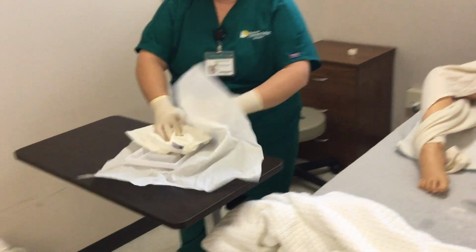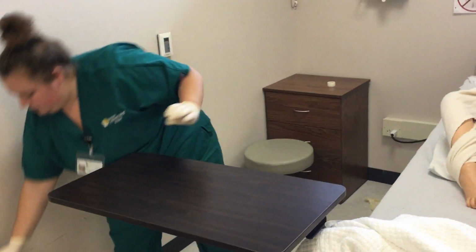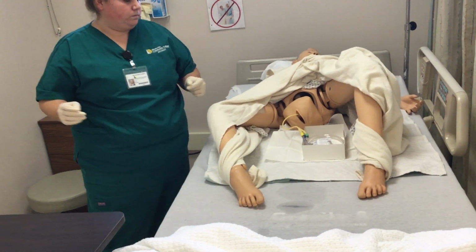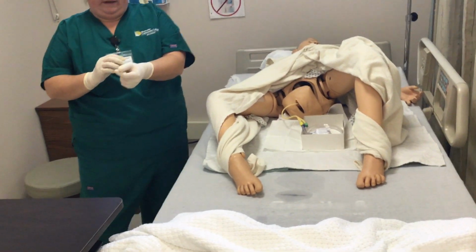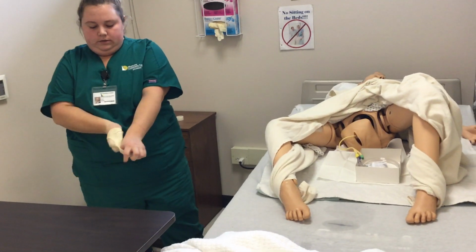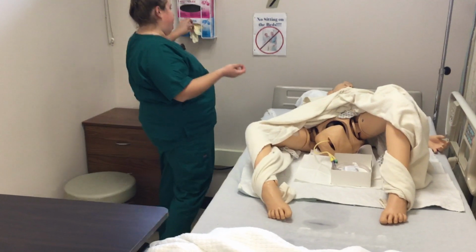This time, I'm just going to remove my gloves and perform hand hygiene. Open this. And then I'm going to put new gloves on.